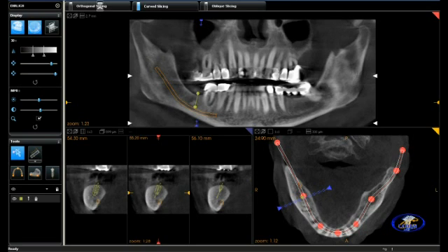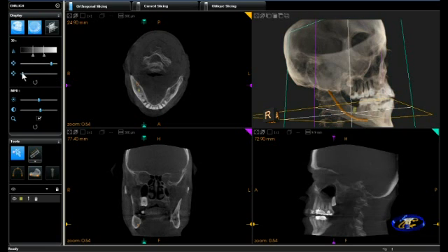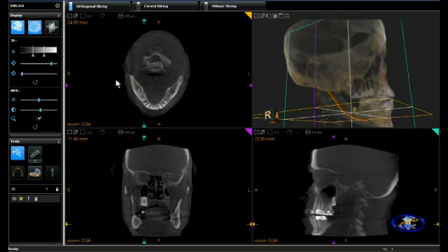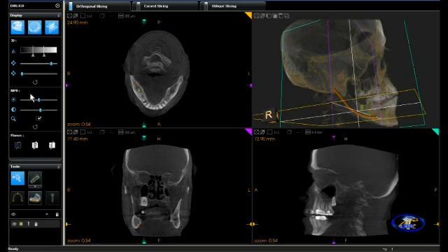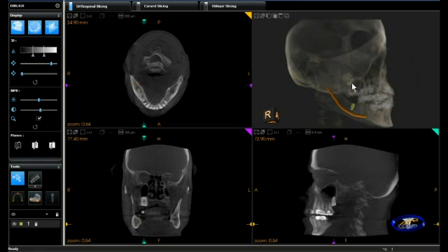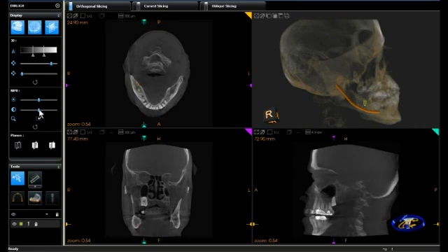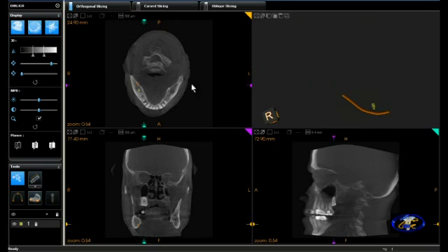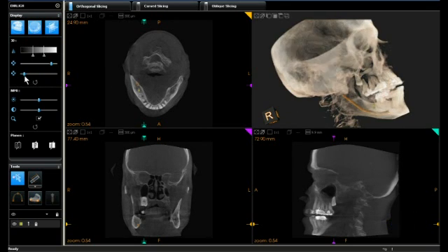In the lower right mandible we make fine adjustments to the implant, making sure we're not in contact with the nerve canal. If we return to the orthogonal slices and volume, we can increase transparency to the volume and then clearly see the marked nerve canal and the implant, ensuring these two structures — the nerve and the proposed implant — don't make any contact. That concludes this presentation featuring the 9500 full field volume.